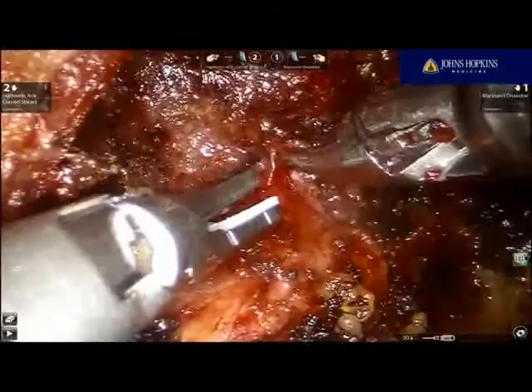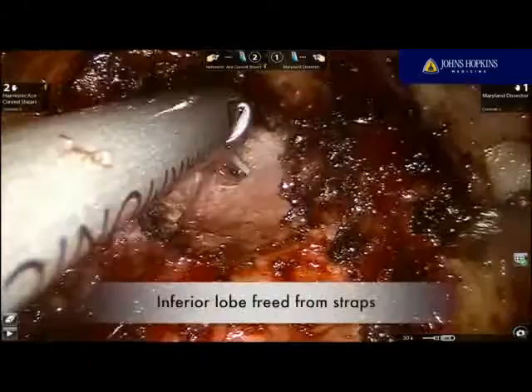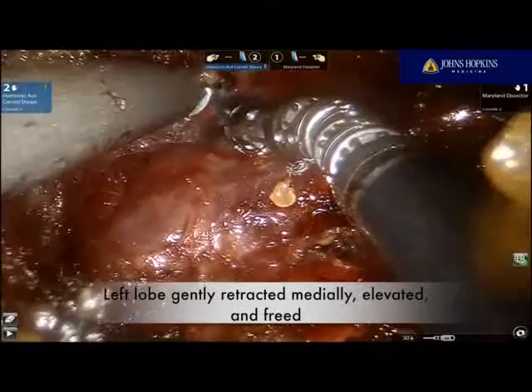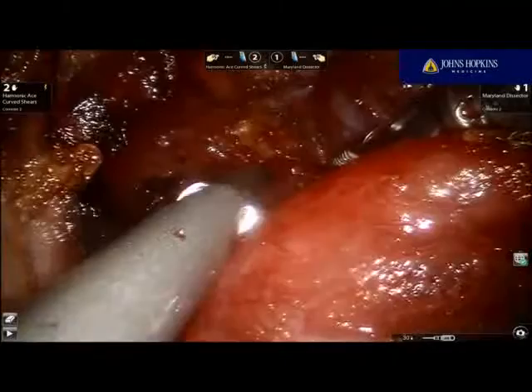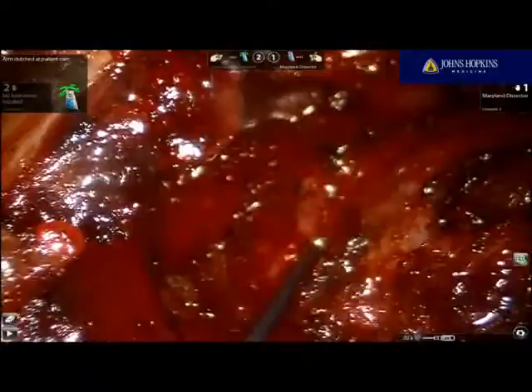At this point the laparoscopic instruments are removed and the da Vinci SI robot is docked. All further dissection of the thyroid lobe is done with the robot with excellent three-dimensional visualization and wristed instrumentation. A standard left thyroid lobectomy is then performed. One of the advantages of the robotic instrumentation is the wristed instrumentation, which allows you to curve around the thyroid lobe, grasp it, and retract it medially. Here we have a long blunt-tipped nerve stimulating probe, which confirms electrical integrity of the recurrent laryngeal nerve.